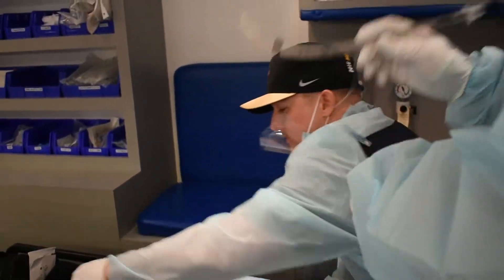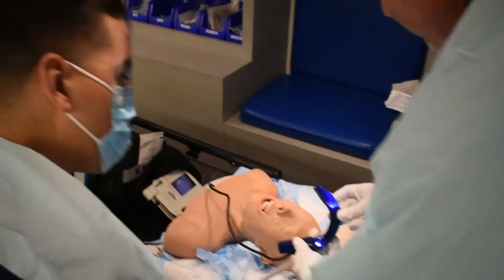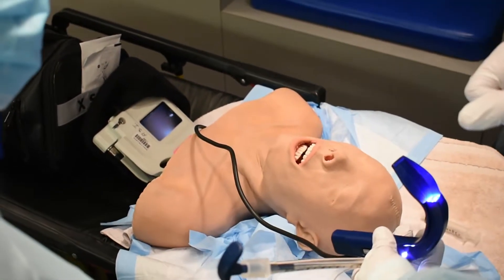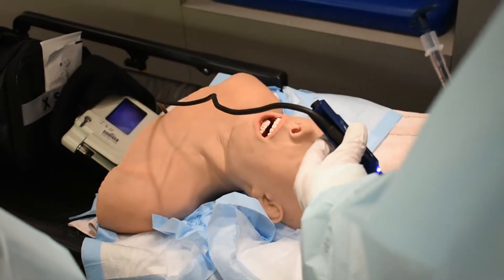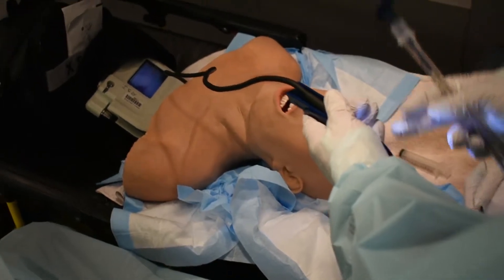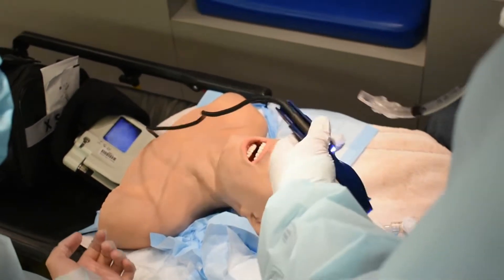With the GlideScope, go ahead and turn it on. I technically turn it on as I'm setting up for intubation, because the screen's anti-fog works by letting it warm up first. If you just turn it on and ram it into the airway, there's a good chance the lens is going to fog up and you've just lost your view. This is a video laryngoscopy tool — it is not a device where you can cross over to direct laryngoscopy. You can see how hyper-angular the blade is; you can only intubate with the GlideScope by doing true video laryngoscopy.